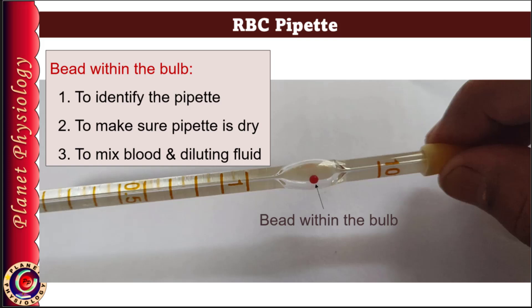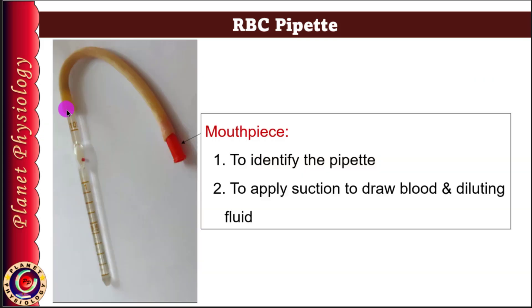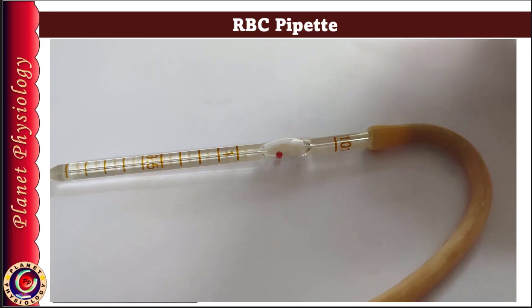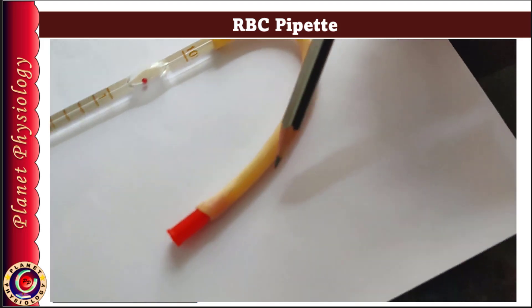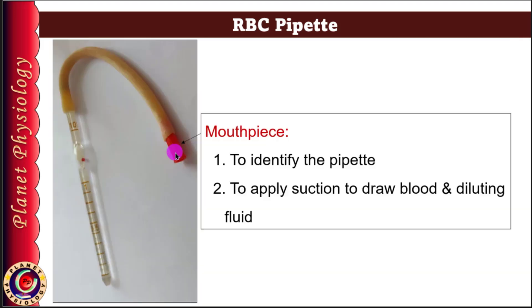Now let's look at the rubber tube attached behind the bulb. The tube is inserted in the last segment of the pipette and does not obstruct the markings and number mentioned after the bulb. The other end of the tube is fitted with a detachable mouthpiece, which is red-colored in the case of the RBC pipette. This mouthpiece not only supports the color scheme for easy identification, but also enables you to obtain the blood sample by applying a gentle suction.